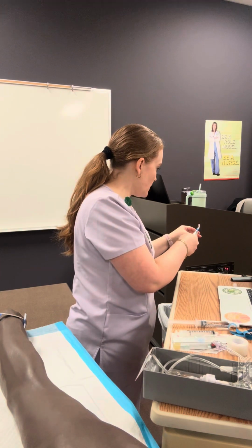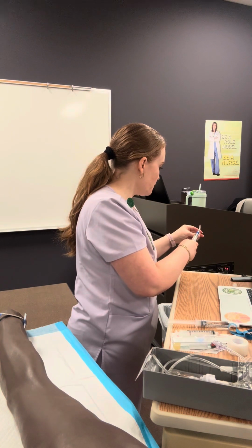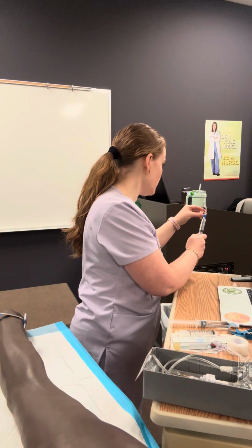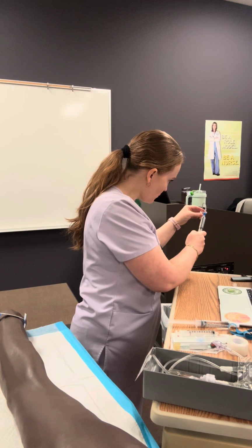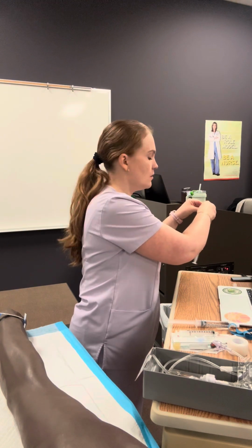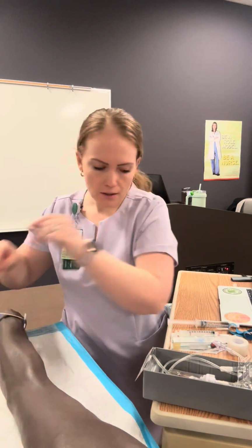It has a cap on that side, so I'm going to go nice and slow. I'm going to make sure I don't have any air bubbles. Once that is primed, I'm going to clamp and set this in my working area here.